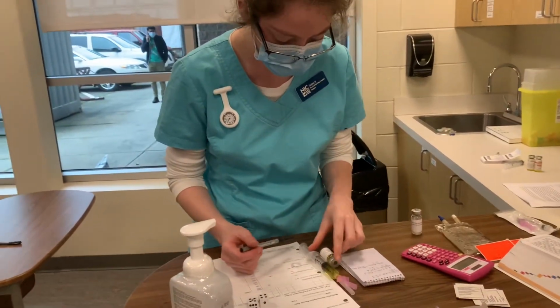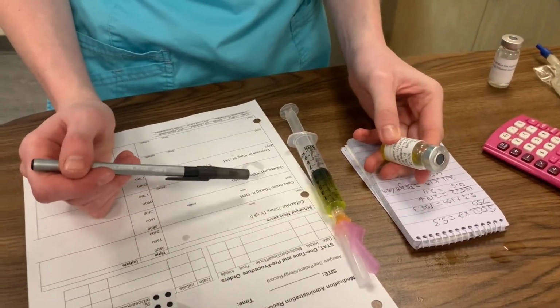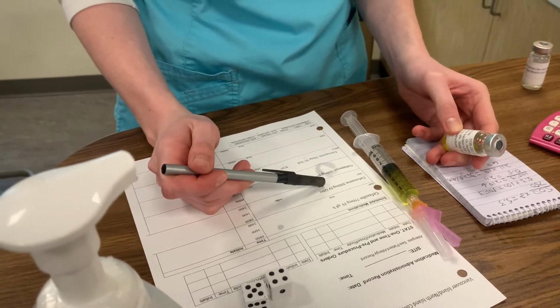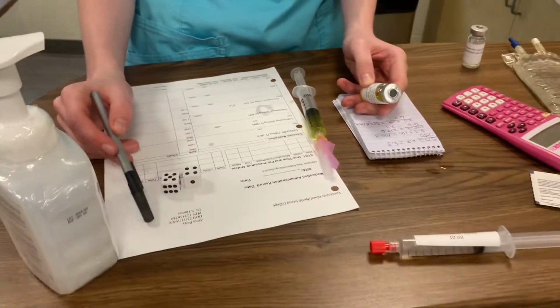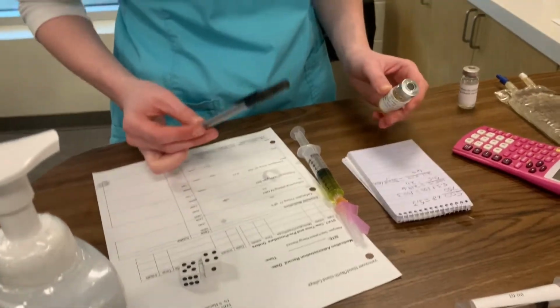I have cefuroximine, 500 milligrams in 5.3 milliliters as a prophylactic antibiotic via IV every 8 hours at 8 o'clock in the morning for Anna Perry on today's date. And here's the documentation. So that's my second check.